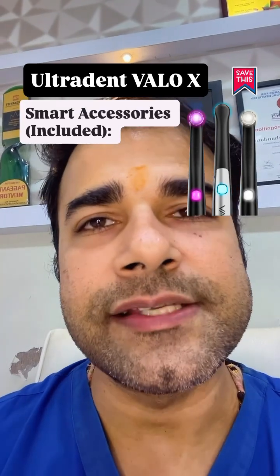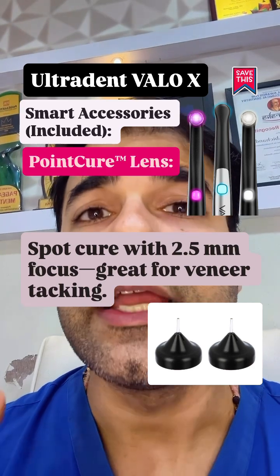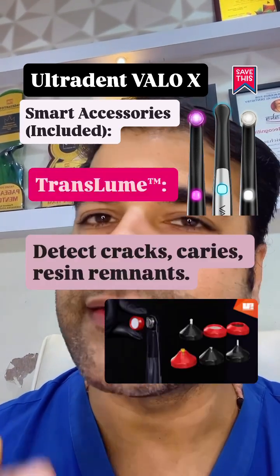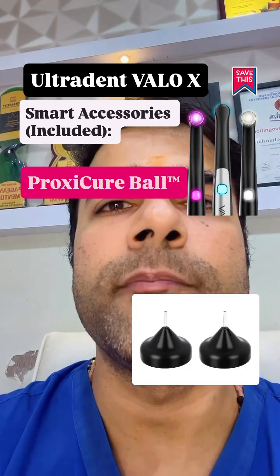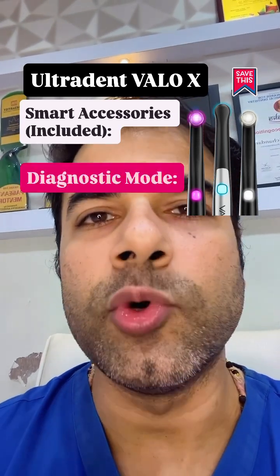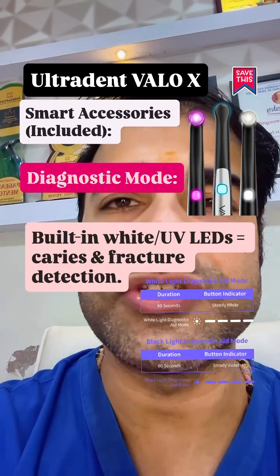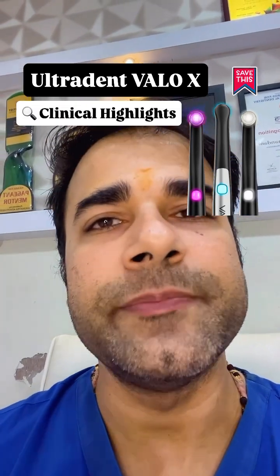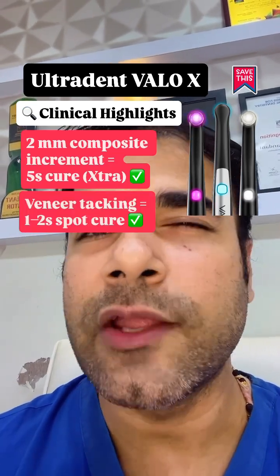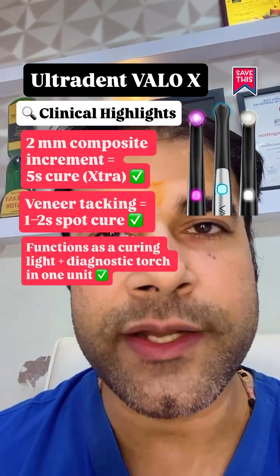Smart accessories include the Point Cure Lens for 2.5 mm spot curing — great for veneer tacking. Translume detects cracks, caries, and resin remnants. Proxy Cure Ball shapes tight contacts during curing. The diagnostic mode features built-in white UV LEDs for caries and fracture detection. Clinical highlights: 2 mm composite increments cure in 5 seconds, veneer tacking in 1–2 second spot cure, functioning as both a curing light and diagnostic torch in one unit.